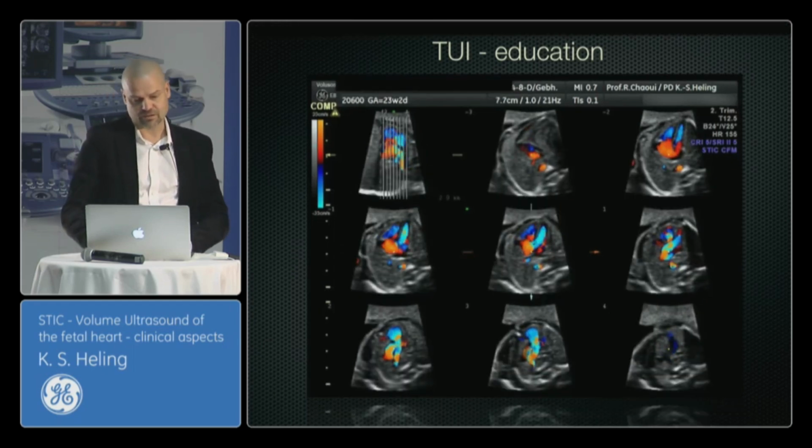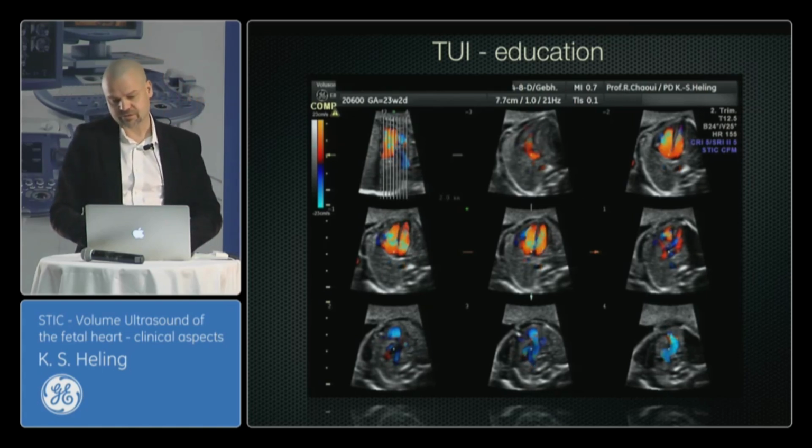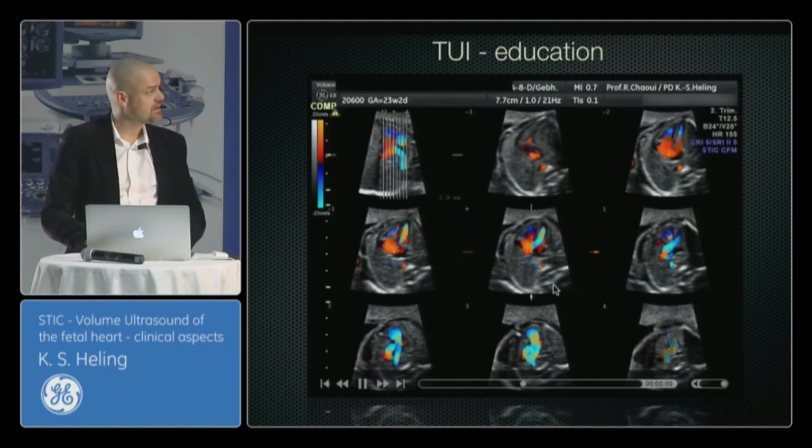And the next is also a severe heart defect, detected in screening ultrasound at 23 weeks. We start in the plane of the four-chamber view: normal four-chamber view, normal diastolic filling of the ventricles. We go to the great vessels, the aorta coming from the left, going to the right. The pulmonary trunk is coming from the right ventricle, overcrossing of the great vessels. What's wrong with this heart?